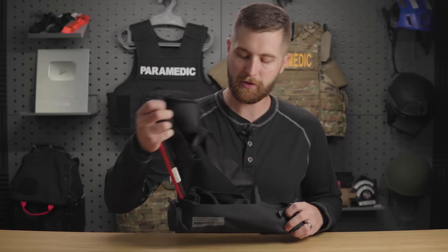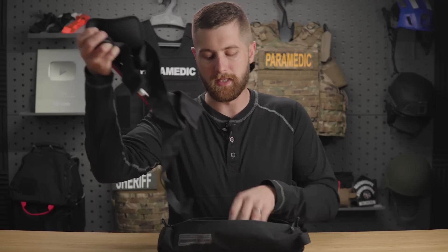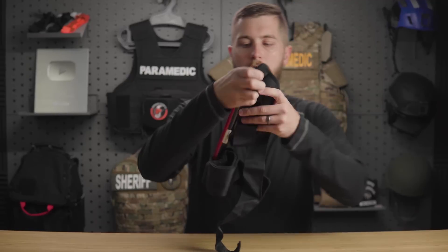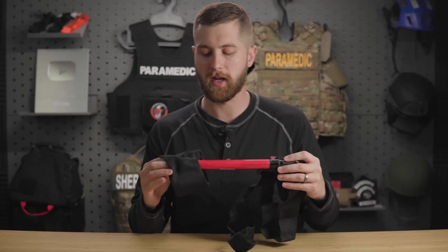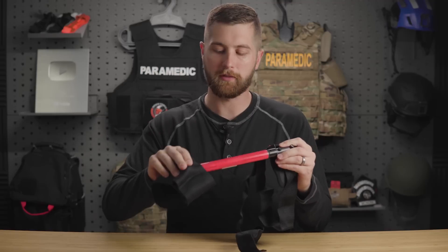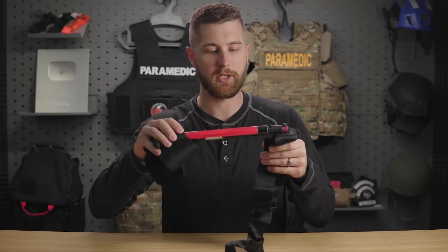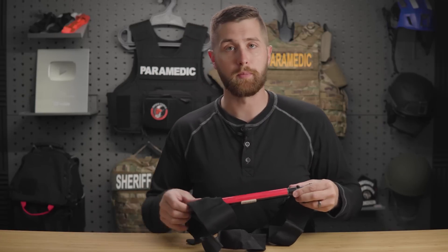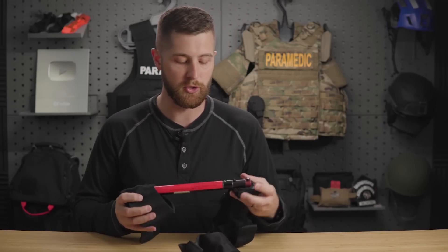Coming into the case to actually get to the traction splint — when you open it up, what's really nice about the Schlischmann is that it is one piece. Technically it's two because there is a strap for rotational stability, but you really only have this one piece. There's no tent poles to assemble, not a ton of straps. You have a permanently attached ankle strap, a permanently attached thigh strap, and then the bar in the middle. What's really nice is that this works for both adult and pediatric patients — you don't need a separate device for either one.